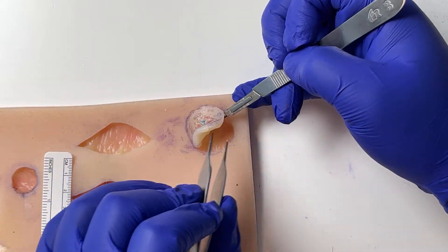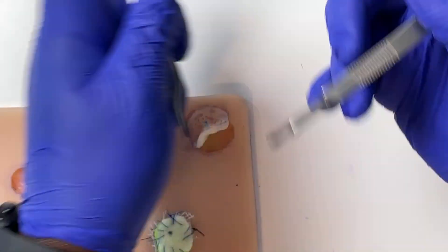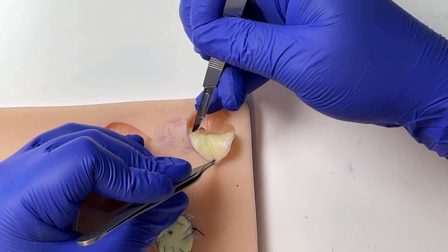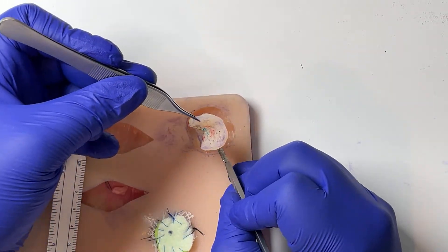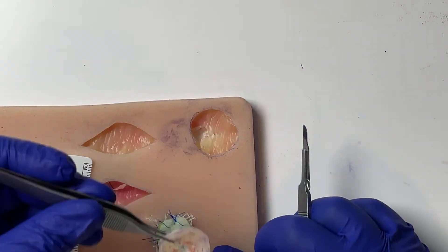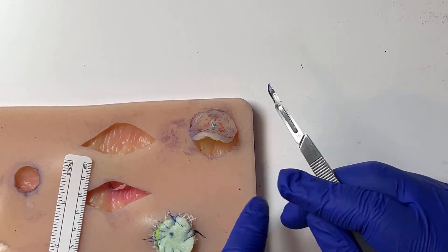Before you take it off completely, put a marker stitch in — I always put it in the same place: 12 o'clock superior, or on the limb 12 o'clock proximal at the highest point. Doing it consistently means that if you forget to label the specimen and the lab asks, you always know where it is. Put your marker stitch in the same place everywhere.